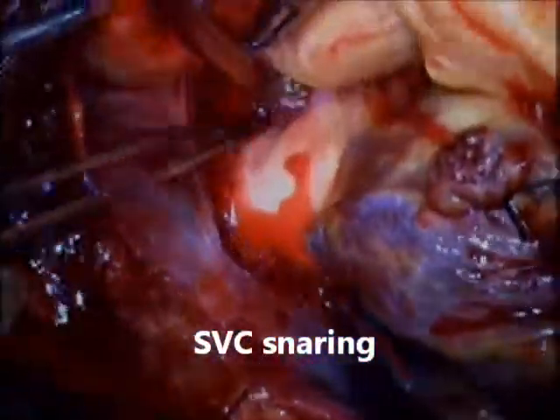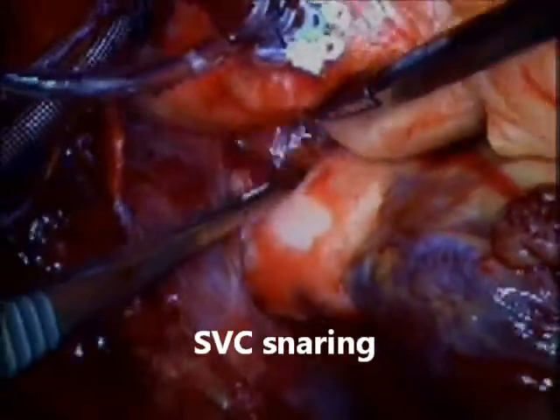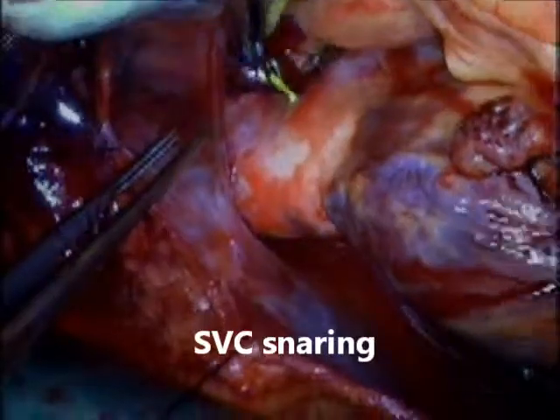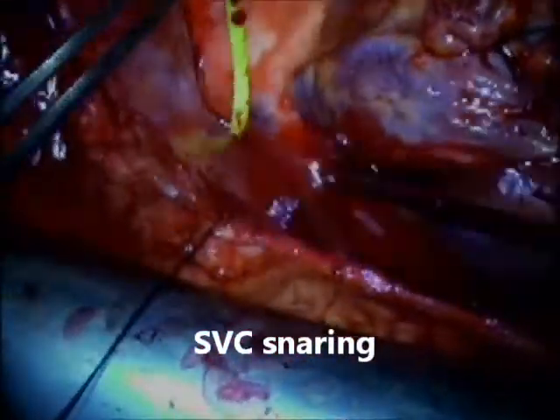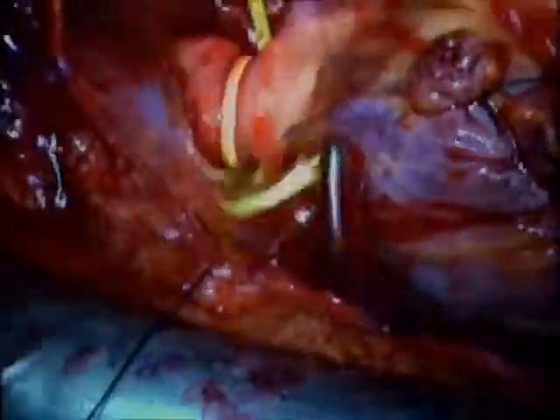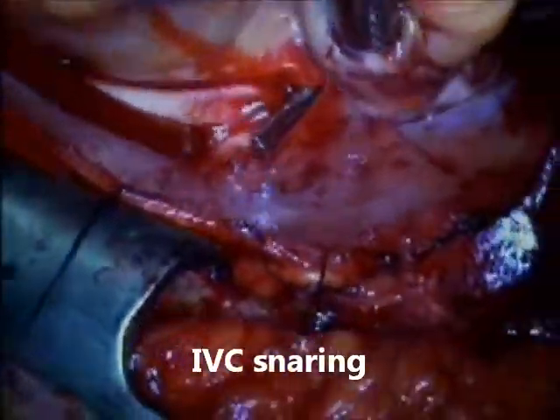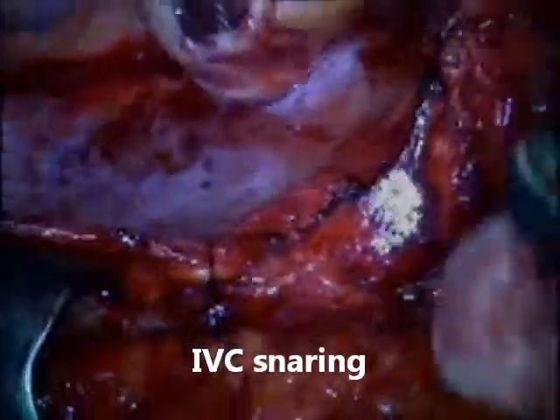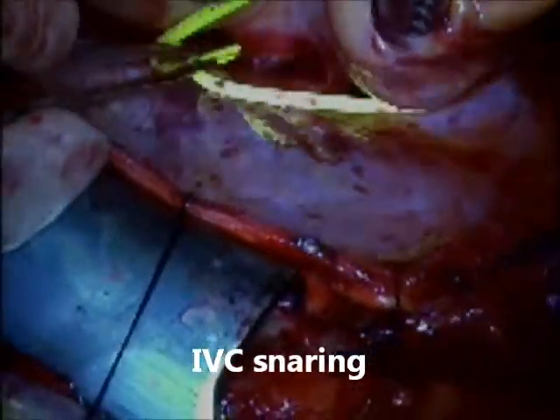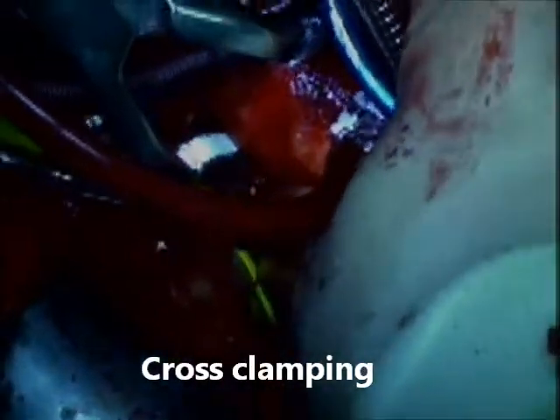Once the patient had bicaval cannulation and aortic cannulation, we go on pump and start with the encircling of the superior vena cava and inferior vena cava with yellow vessel loops, which I like to use because they give me a good sense of how tight I can make my snare in order to obtain good hemostasis. The same thing is done on the inferior vena cava, always using a double loop with a C-clamp that allows a good curve around the SVC and IVC.